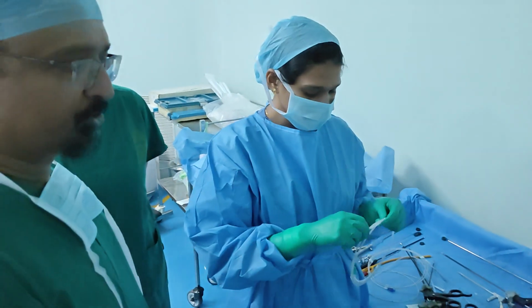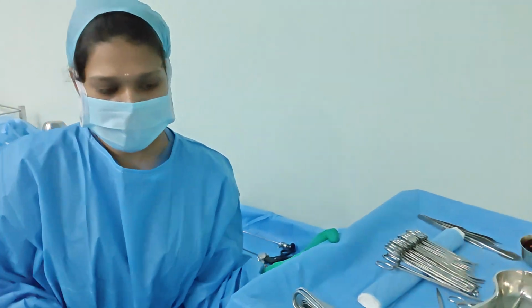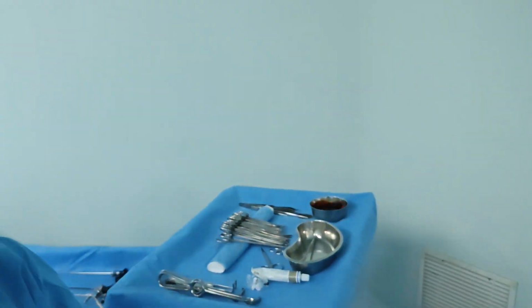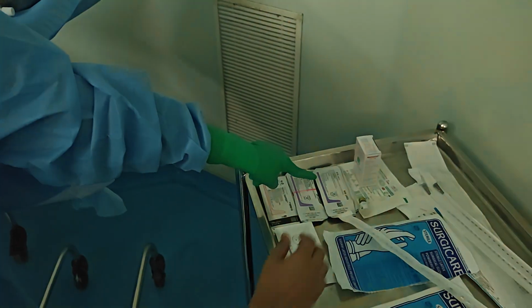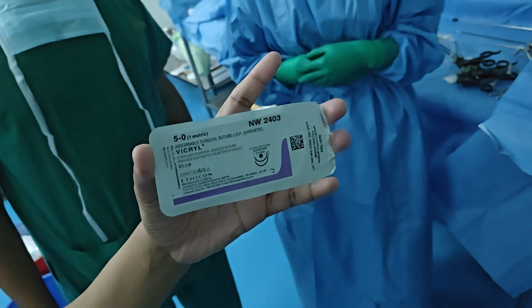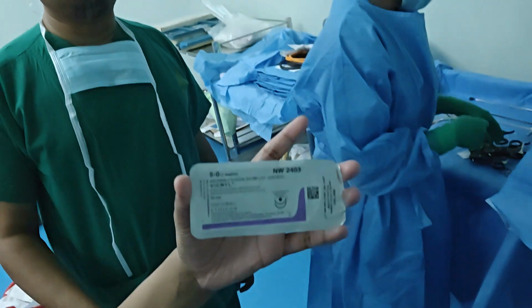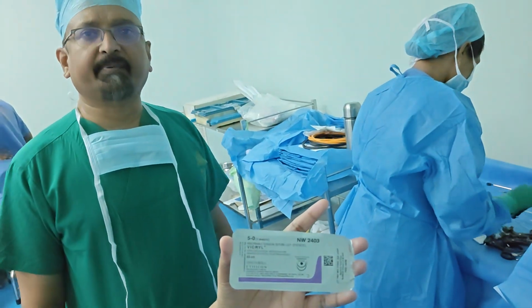Very good. And what about the suture materials? Can you show the suture material? What all suture materials do you have? Mainly for the pyeloplasty, what suture material do we have? 5-0 Vicryl double arm. So we have the suture material 5-0 Vicryl double arm. We use it because one arm can be used for the anterior layer and the other for the posterior layer.